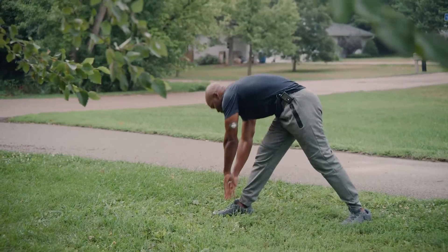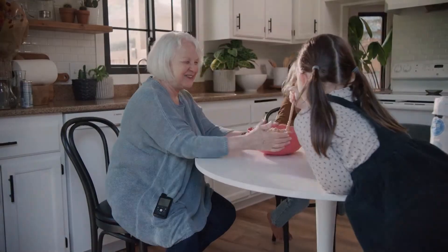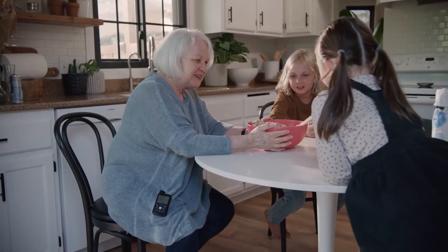Hi there! Around here, we like to think of your MiniMed insulin pump as a trusted sidekick. It goes everywhere with you and is always by your side. Since it goes along for so many of your life adventures, why not take a few minutes to keep your sidekick in tip-top shape? Here are some helpful tips to keep your pump protected.